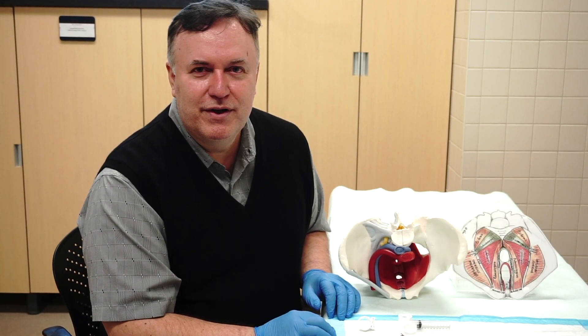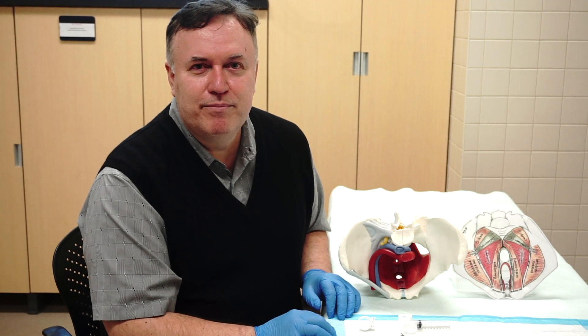I'm going to demonstrate trigger point injections to the pelvic floor for the patient with chronic pelvic pain.